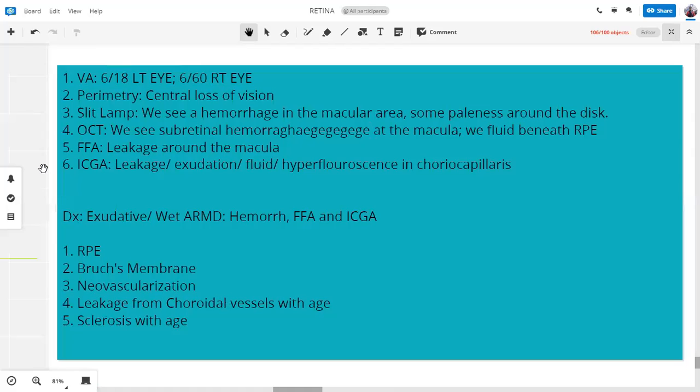Macular degeneration? No, that is called pigment epithelial detachment. Well, that is a sign or a finding. That is not a choroidal detachment. Now, if the choroid detaches from the underlying sclera, or detaches completely from the retina and the sclera, then that is called choroidal detachment. The point of saying this is that the detachments which we see on the OCT can be of different types.